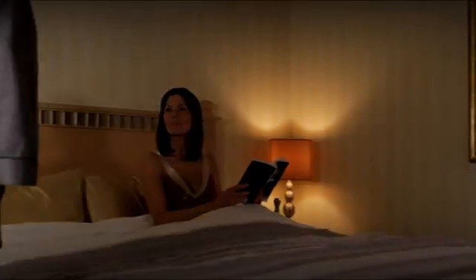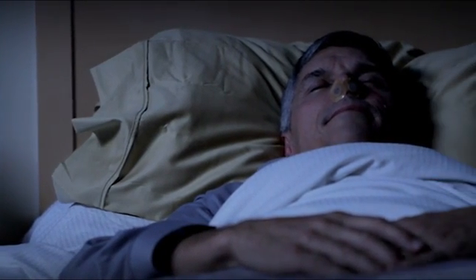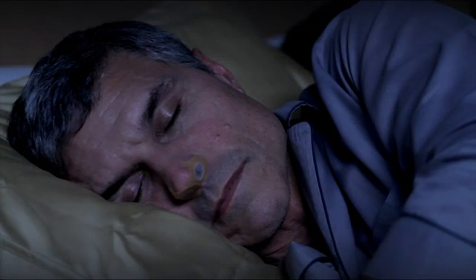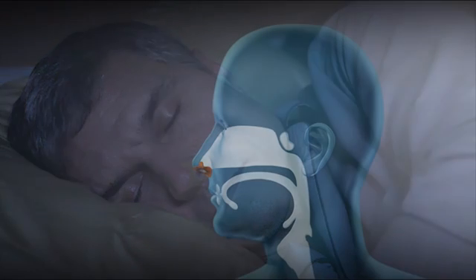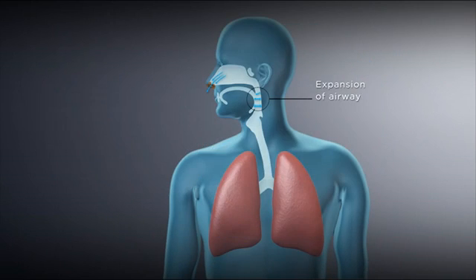Put on the Provent devices right before bed and breathe through your mouth while you fall asleep. Most people will switch to nasal breathing after they fall asleep, and the device will start working. It is important to remember the following when you are getting used to breathing with Provent Therapy. The device works by making it harder to breathe out. This creates pressure in your airway and helps keep your airway open.